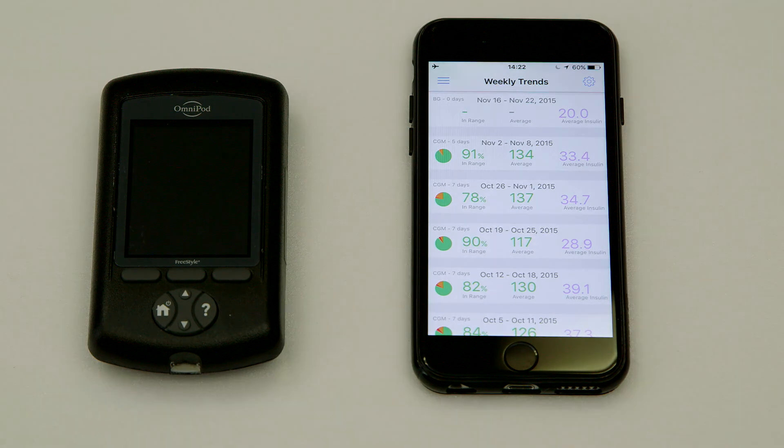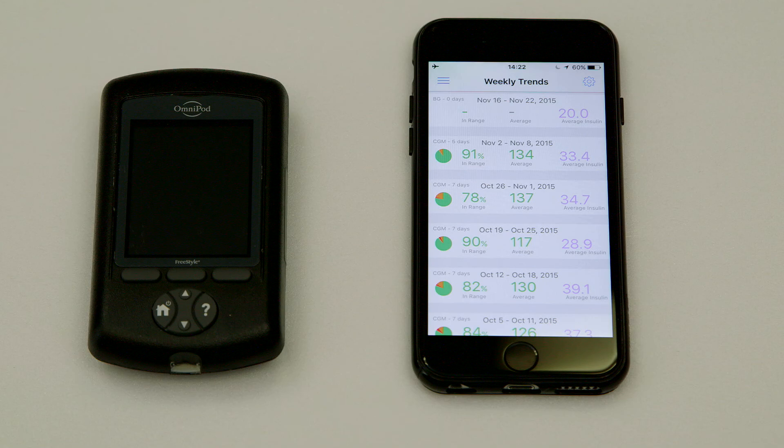That's it! Now you know where to find all of your PDM data within the Gluco app for iOS. Happy syncing!